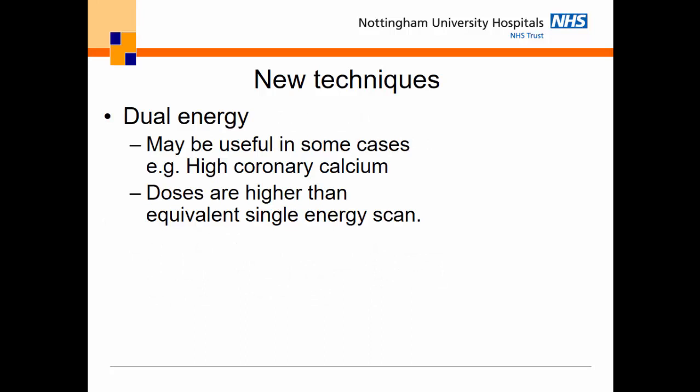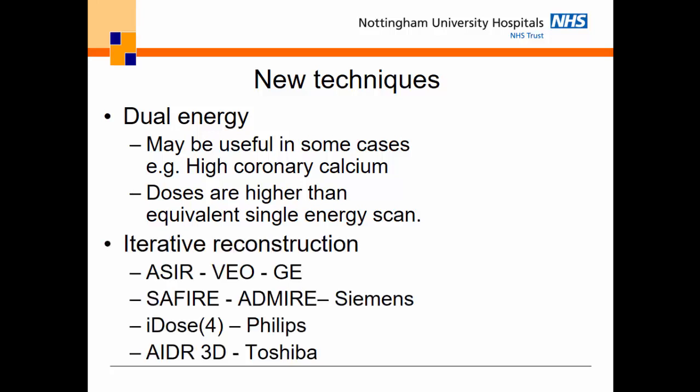There are new techniques in terms of dual energy. You've probably heard the reps talk about these. They may be useful in some cases. I think it's mainly a research tool, and you have to remember that no matter what the manufacturers tell you, the doses are higher than the single scan equivalent. So dual energy might have its place, but bear in mind it is going to increase your doses.